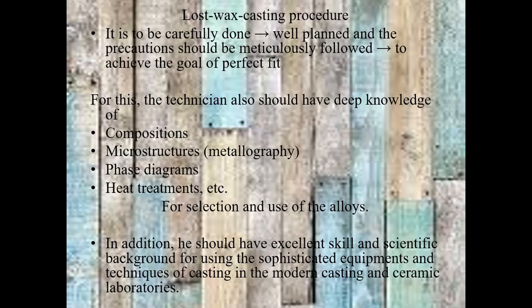Now, the entire procedure which I have been talking about should be done very carefully and well planned, and preparation should be meticulously followed to achieve the goal of perfect fit of the prosthesis. The tooth preparation and the impression making is usually performed by the dentist. The rest of the part which I have explained, the casting procedure, that is from the start of pouring a cast till the procedure of finishing and polishing of the crown, is usually performed by a technician.